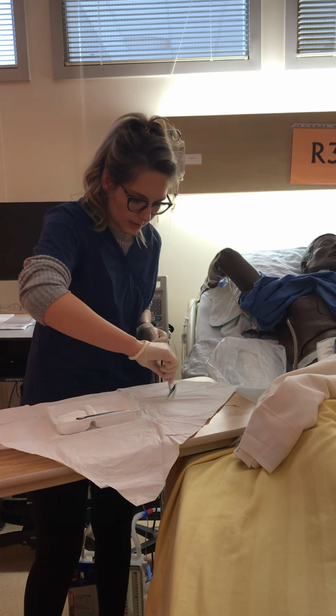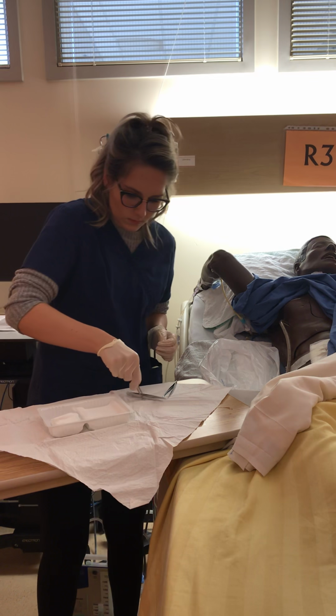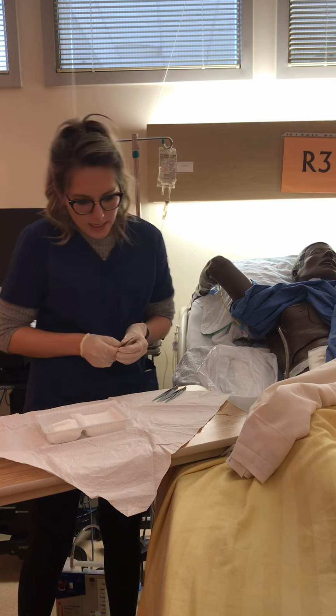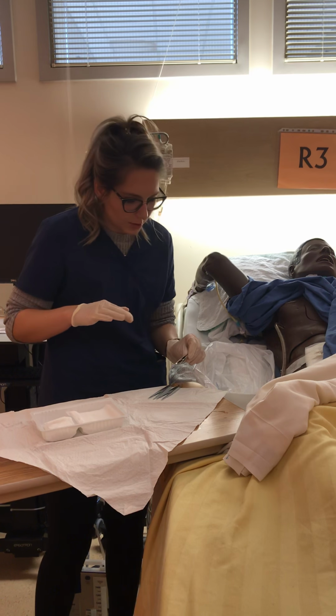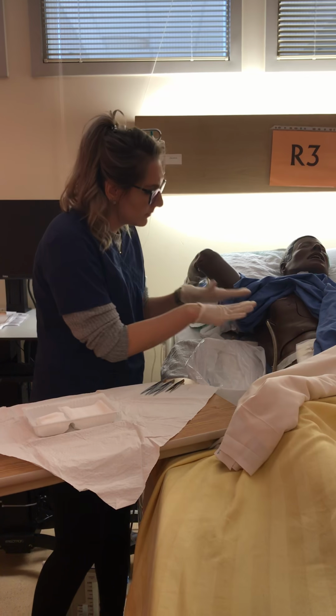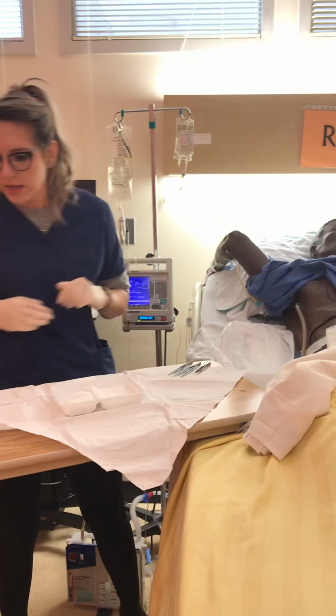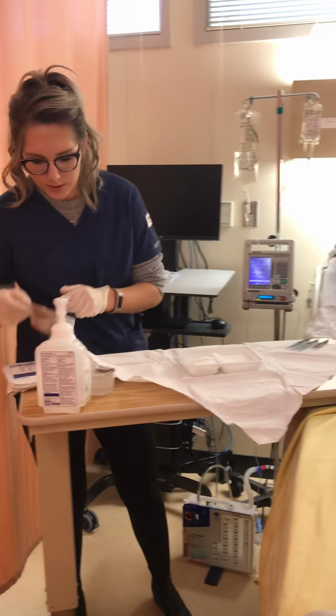These are waterproof on either side. So I'm also assessing the site. Before I remove that dressing, I should have assessed the site for subcutaneous emphysema. I could still do that by palpating around the area, not by the stoma there. And I just note the color and drainage of the stoma.